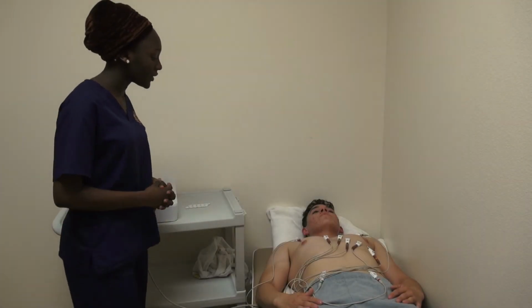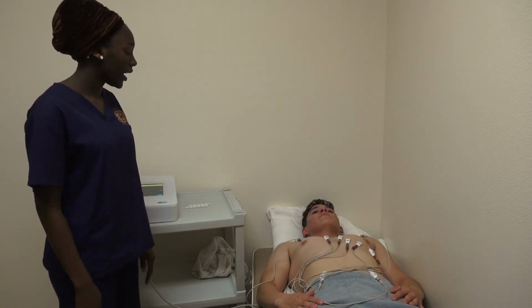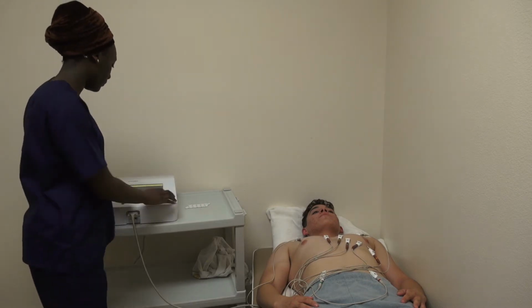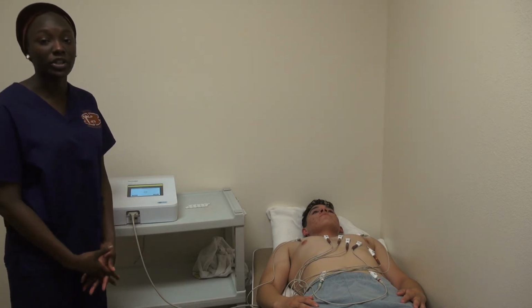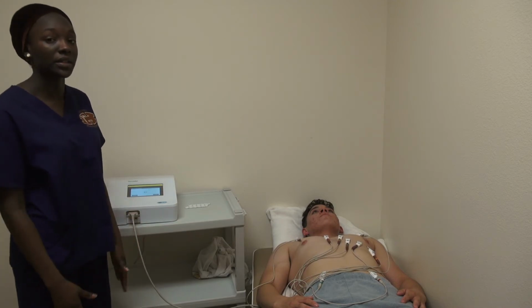Now that all of the leads are in place, Mr. Rogers, I'm going to ask you to have your hands on both sides and just relax and breathe normally as the EKG machine will record. Now this usually takes 10 seconds for the machine to pick up on the rhythm of the heart as the patient is completely still.